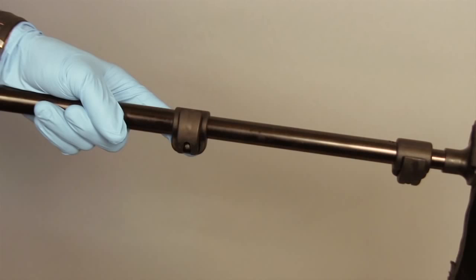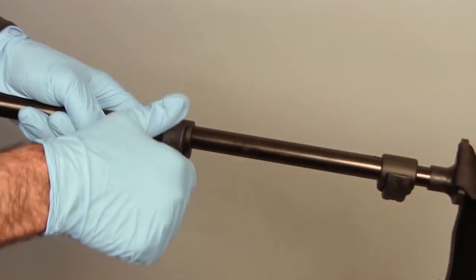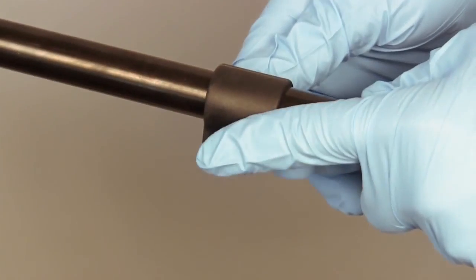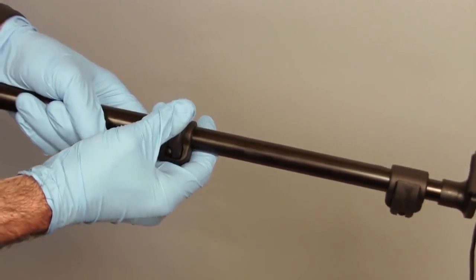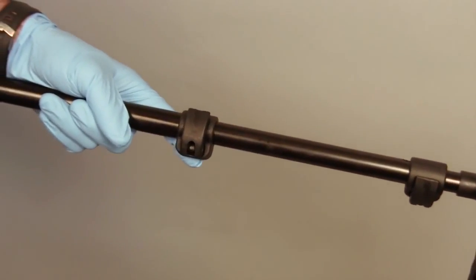The two clamps on the pole are adjusted prior to shipment, but should they require adjustment, this is easily done. Simply open the clamp, hold the screw on the back, and turn the clamp lever to tighten or loosen it. Don't over-tighten it — go one turn at a time and you'll quickly find the sweet spot.